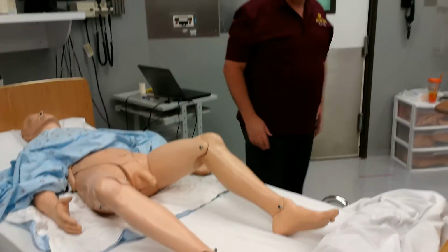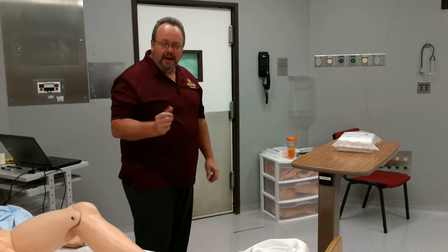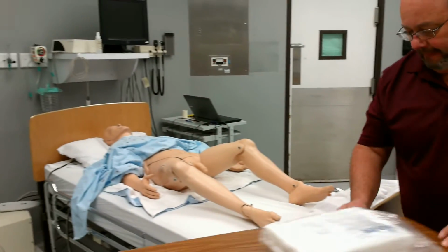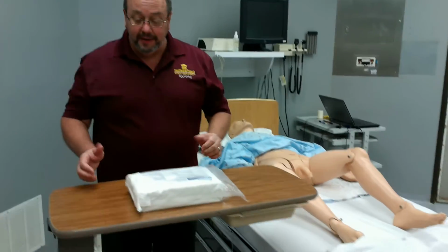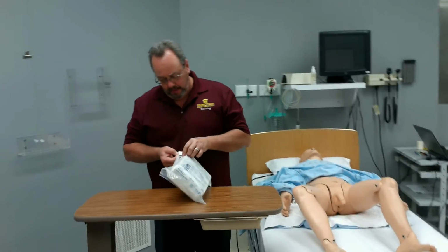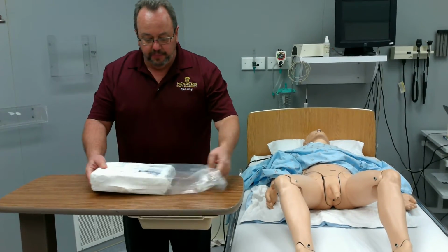And now that I have him positioned, I have to position my table, depending on if you're right or left-handed. Seeing that my dominant hand is right, I'm going to come to this side of the bed with my table and set it here at the foot of the table. Then I will open my kit. And to open this kit, you have to pull this white tab. Opening it here, and then just pull it out.